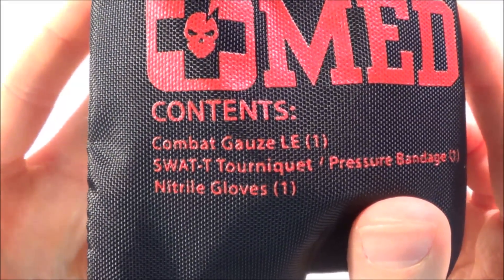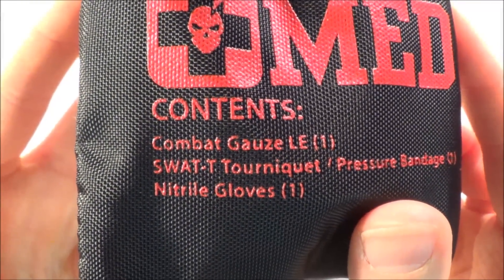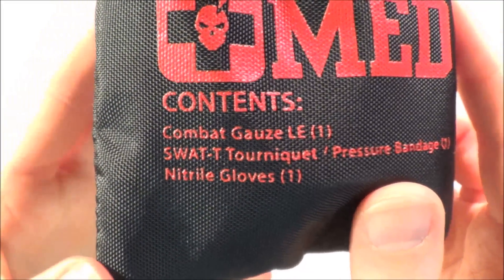The EDC kit comes with combat gauze LE — same QuikClot hemostatic gauze — a SWAT-T tourniquet slash pressure bandage, and nitrile gloves.